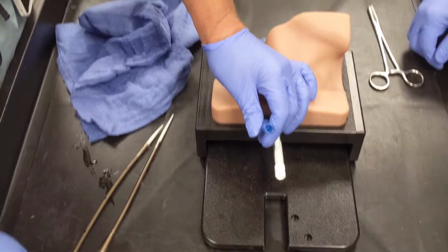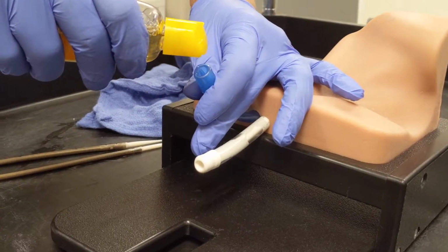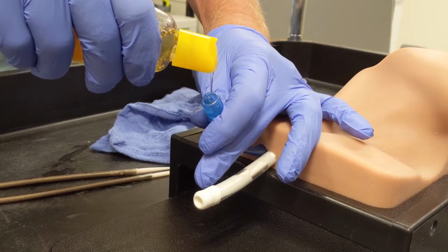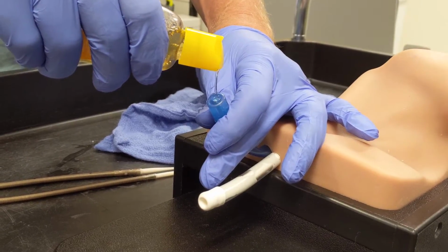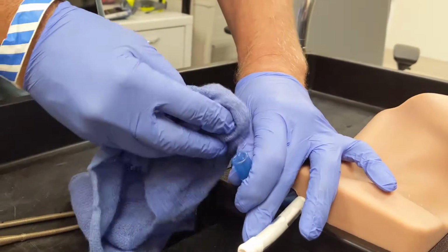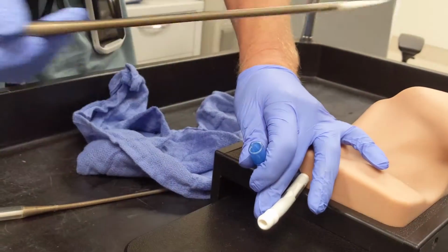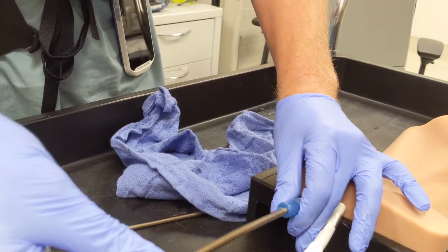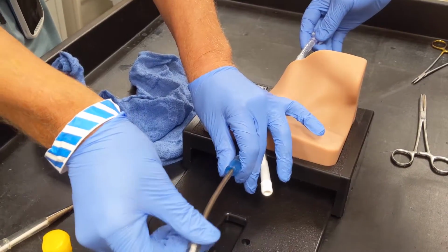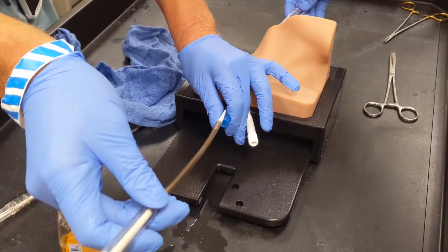Okay, so especially the internal jugular vein, the blue one, we want to put some liquid dish soap, and you just drip it in there. More is better. They don't want it to get on the outside, really. And then use the cannula. 17 French fits perfect for this model, and just gently work it in. You know, don't poke a hole. Just glide it in like that, and it also lubricates the cannula, which is great.